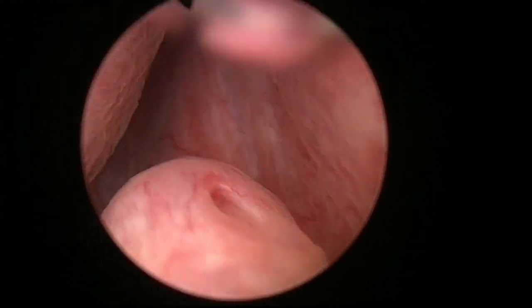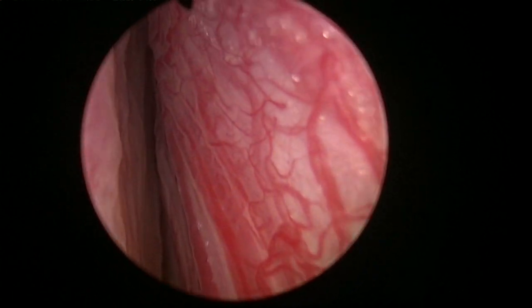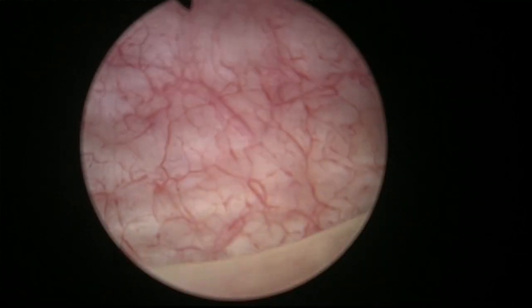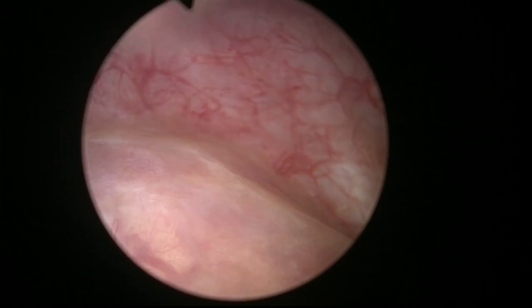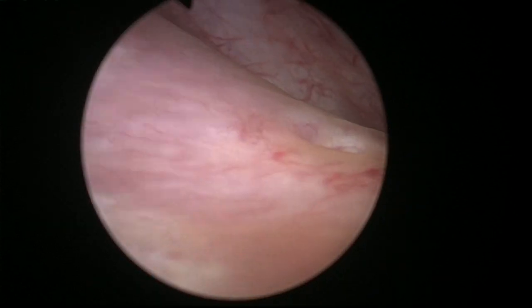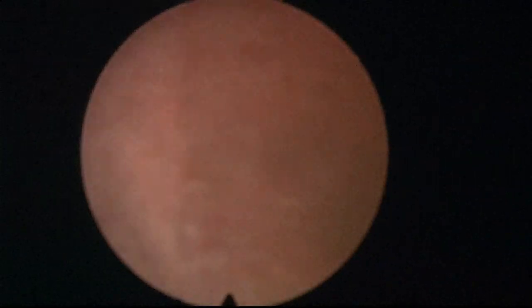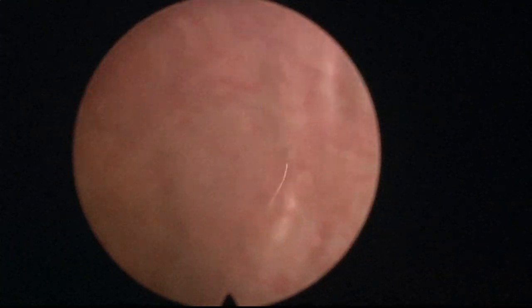And you can tell. This was supposed to be a very large gland. Maybe it's very wide. It's not too long. Yours are close to the edge, so we have to be careful later on. The bladder. A little bit trabeculated, no, but this is very standard, very common in the patients we operate, no?